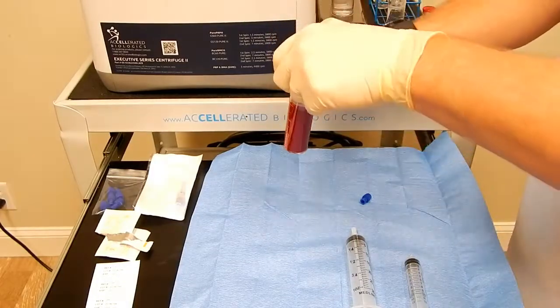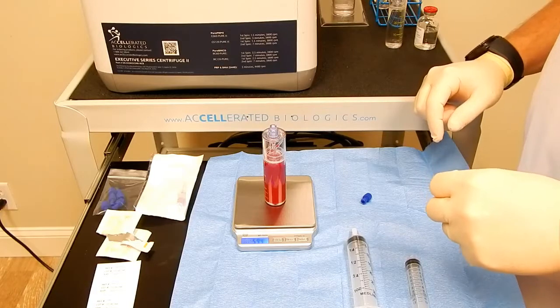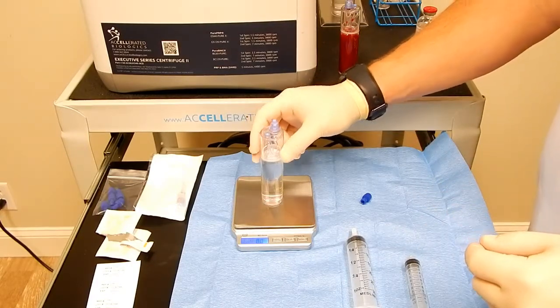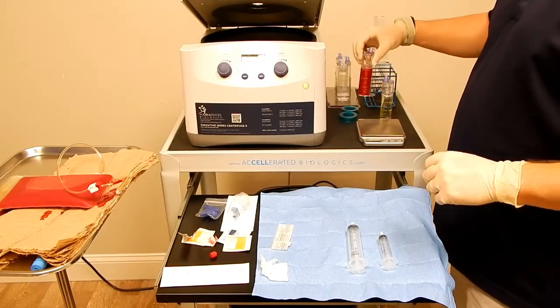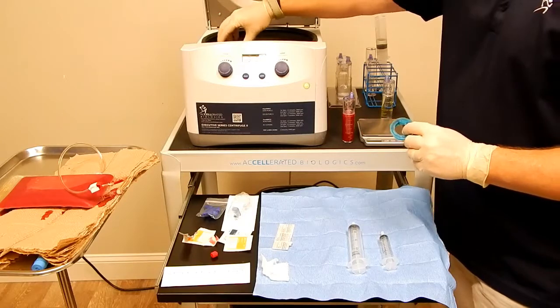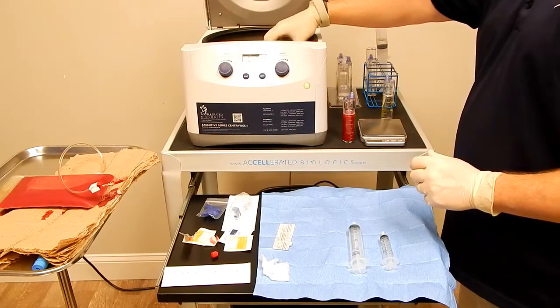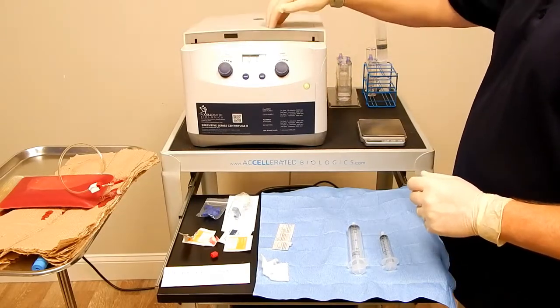We will now weigh our whole blood — 59.4 grams. Hit tare to zero it out. Then do the counterbalance with equal parts water, 30 ml as well — 0.0 grams, right on the money. We have weighed and counterbalanced the blood, and then we will place our inserts inside of our metal buckets. Make sure the buckets are sitting on opposite sides and that they are sitting freely so they can spin horizontally.